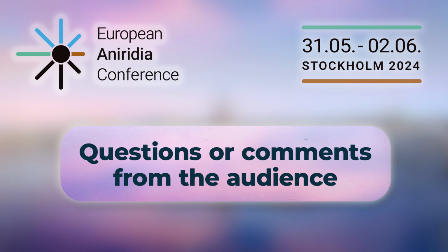Yes. Thanks. Just a comment and then a question. Excellent presentation. So we do use scleral contact lenses for aniridia patients because of the reasons that you mentioned. It's safe, and some patients have highly significant irregular astigmatism and they need it, to be able to function better. But the comment is that aperture optics is now one of the hottest areas of ophthalmology, in particular looking forward into new intraocular lens designs and treatment of keratoconus. You can modify the patient's pupil if they have an iris as one approach, or you can put it in the lens if you're putting it in an intraocular lens.